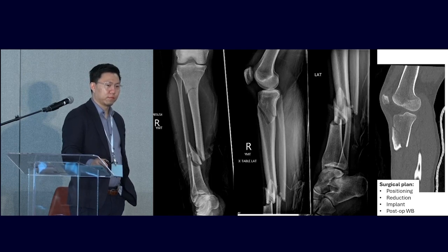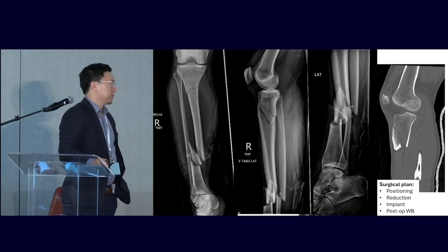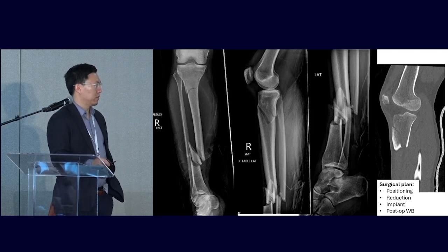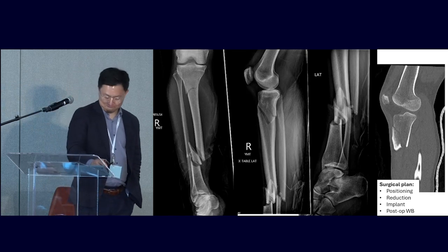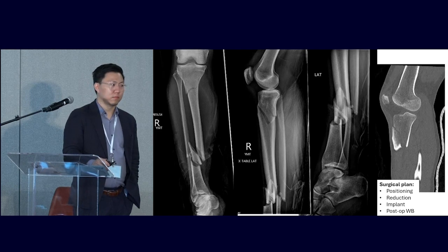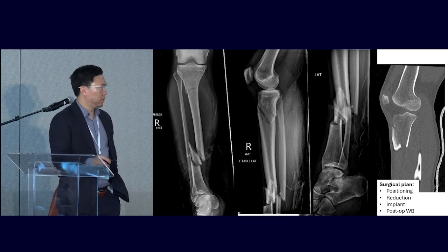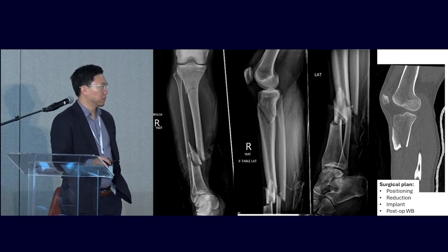So it's almost like a nail plate combo for that we do for the femur. How are you going to reduce the distal piece? So you just put on a provisional, a short proximal plate for the proximal fracture, where you have enough space to still do a nail, and then now it's just an isthmic or a distal shaft fracture that you nail. But it's still a difficult distal fracture to nail, but you can plate the fibula to get your alignment a little better.